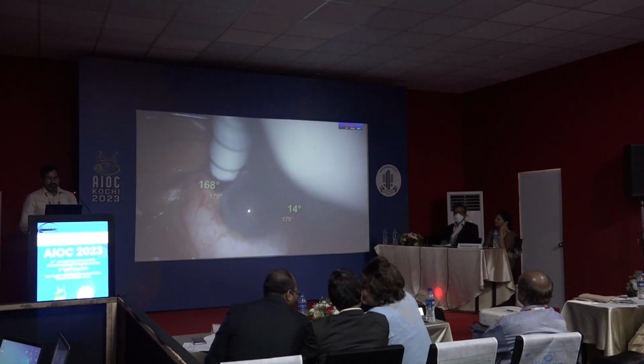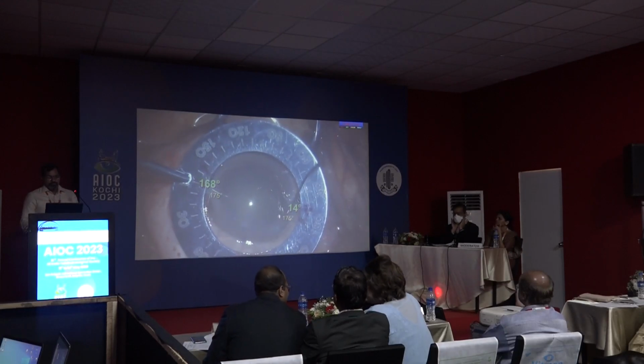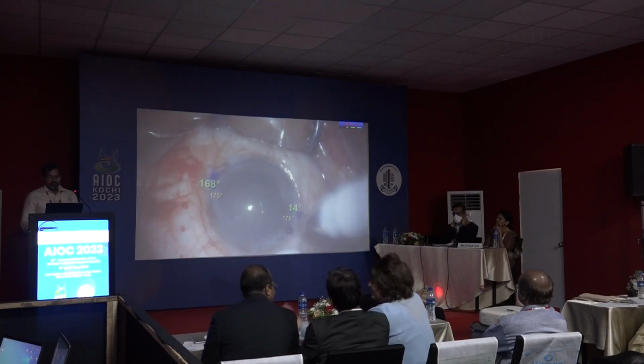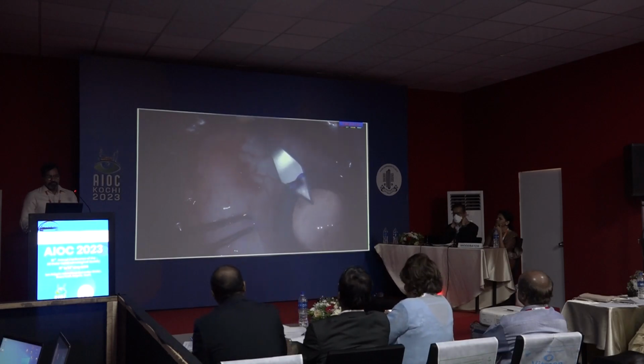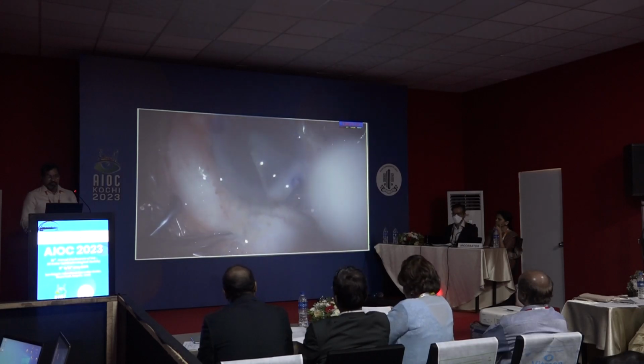Intraoperatively, mark the same points on the limbus using a marker. Using these landmark points as reference, I mark the site of incision at 175 degrees on both sides. After lens implantation, a 2.8mm OCCI was done and the main incision was extended to 5.5mm.